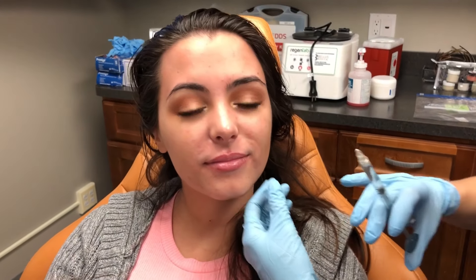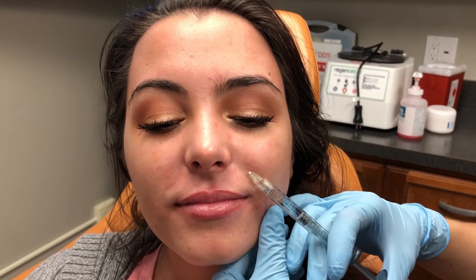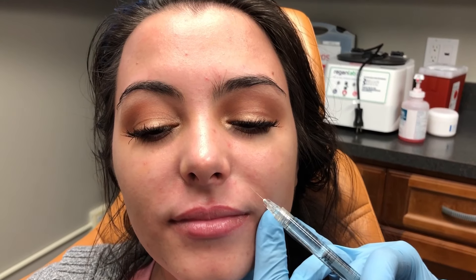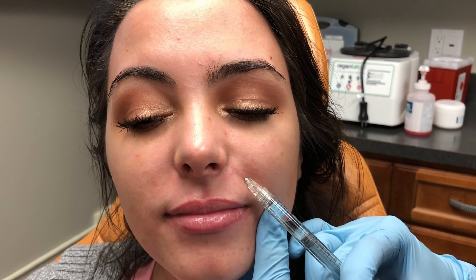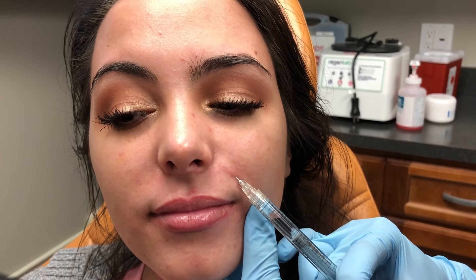She doesn't need a lot of correction in this area, so we're going to go ahead and start. You can just relax. I'm going to measure my needle tip from the hub to the tip, and this is about the area I'm going to start in. I'm going to go right through this fold — she's already been cleaned off and numbed topically. I'm going in at a 45-degree angle into the mid dermis, tenting up. I like where I am, so I'm going to give her a little, let her numb, and then we're going to do a slow retrograde injection down.